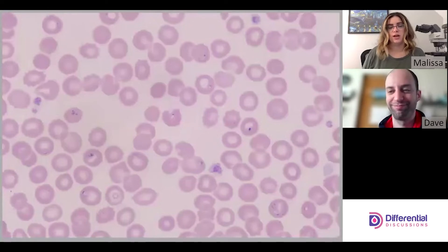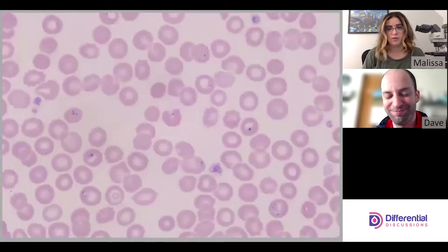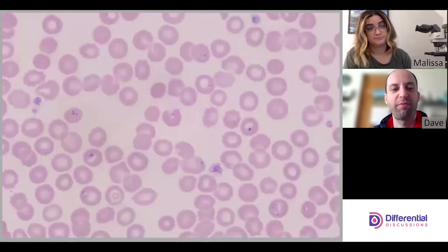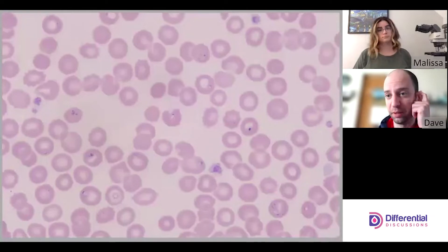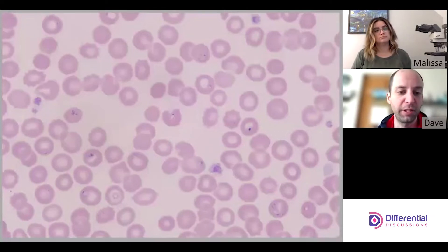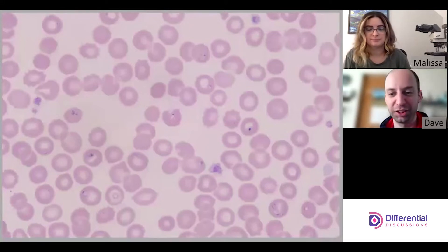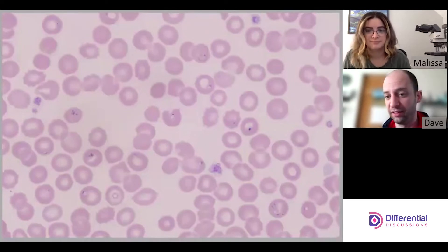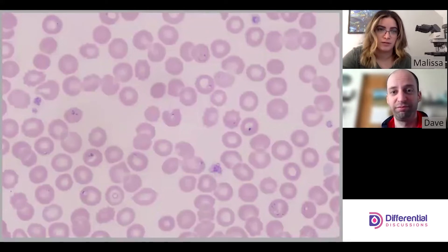Hello and welcome to Differential Discussions. I'm Melissa and I'm Dave, and we're going to continue talking about red cell morphology. We're going to talk about another blood parasite — we're going to talk about Babesia. Babesia is pretty cool and endemic to the area where we are; we're up in the northeast. So summertime comes around and we will see Babesia. This slide has a lot of organisms going on.